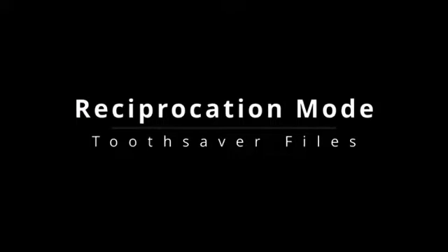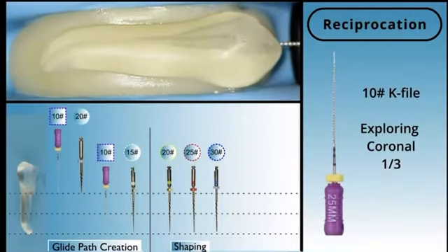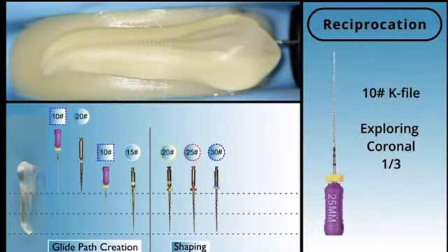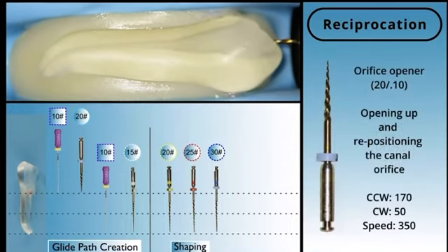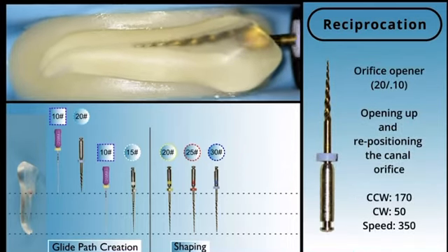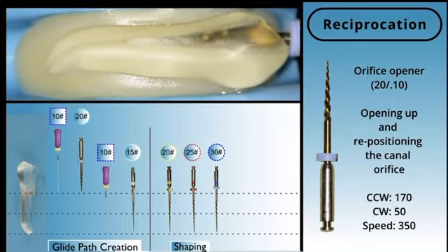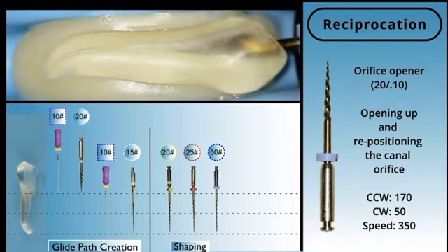Rotary. I'm going to just try this tooth in reciprocation mode just to see how well we get on. And again, the protocol for this is pretty much the same. We're going to explore the coronal third with a size 10K file. We're then going to use the orifice opener. It's a size 20 10 taper. This is again to open up and reposition the canal orifice.